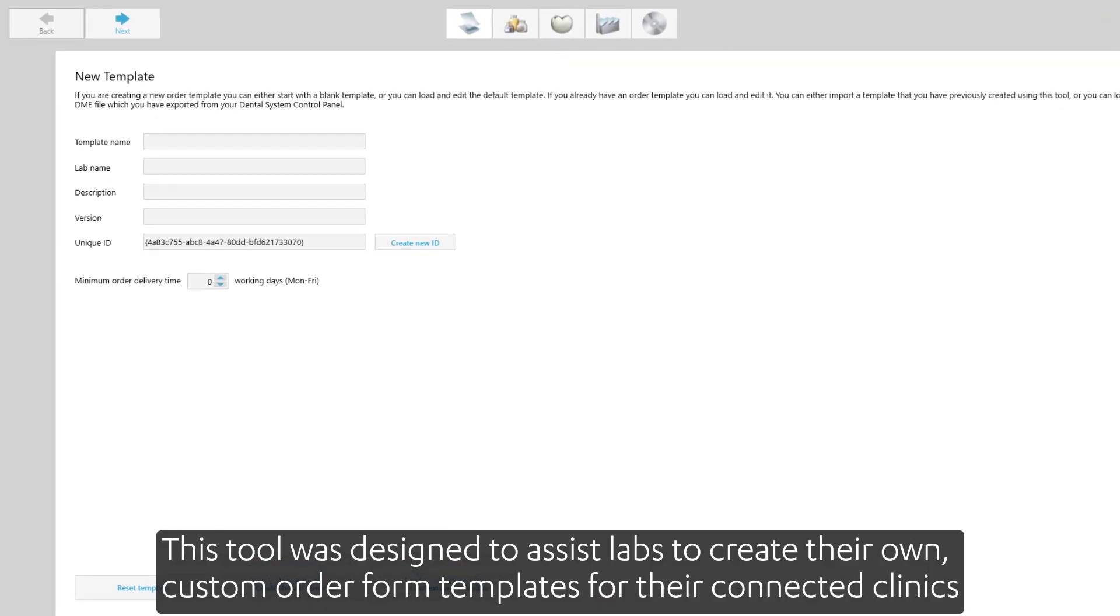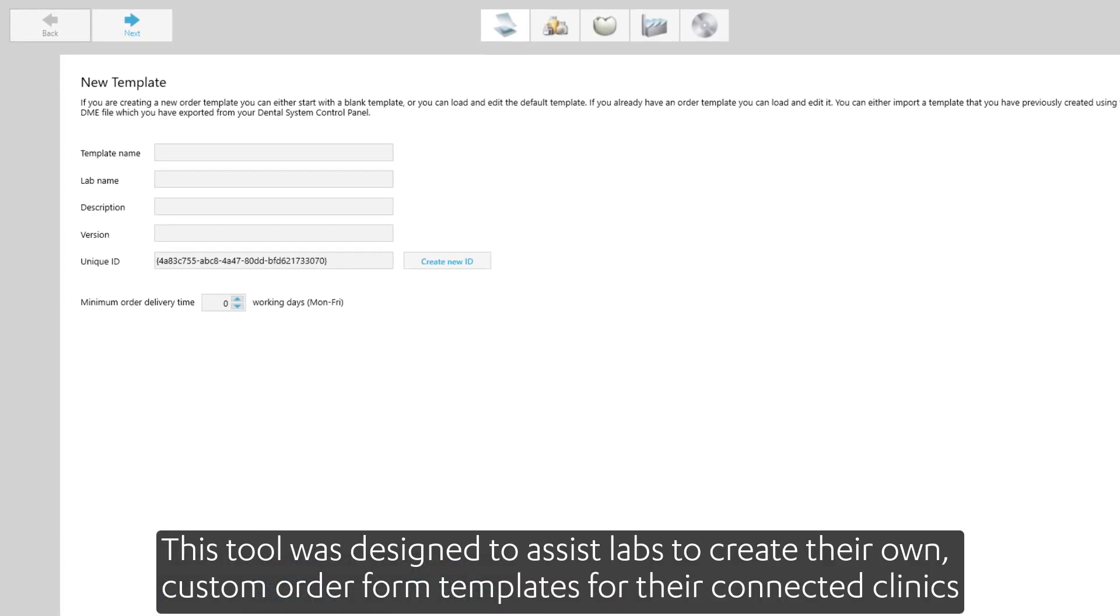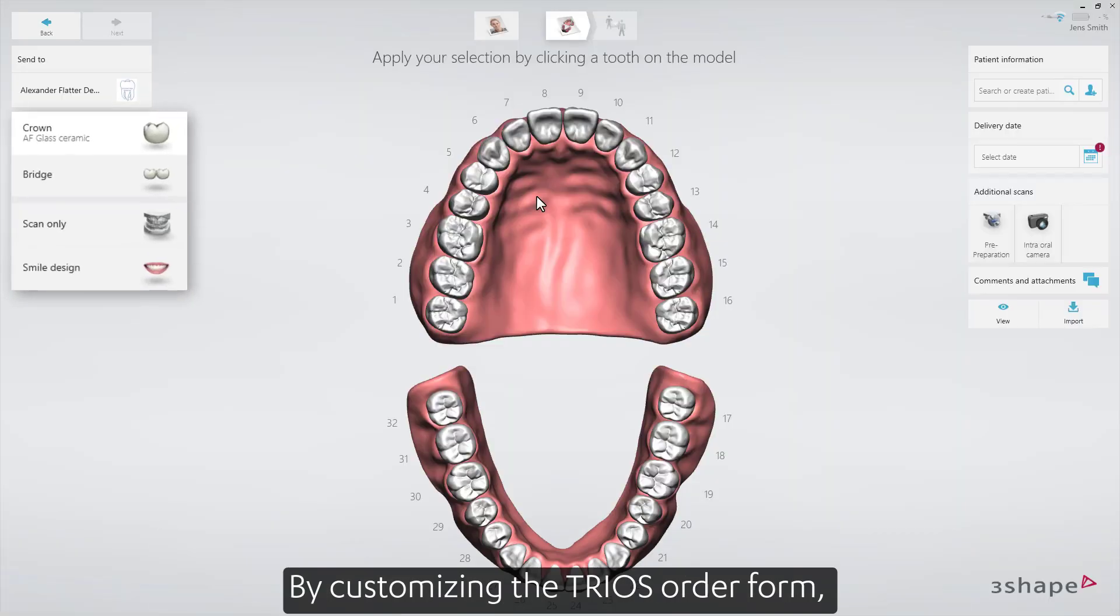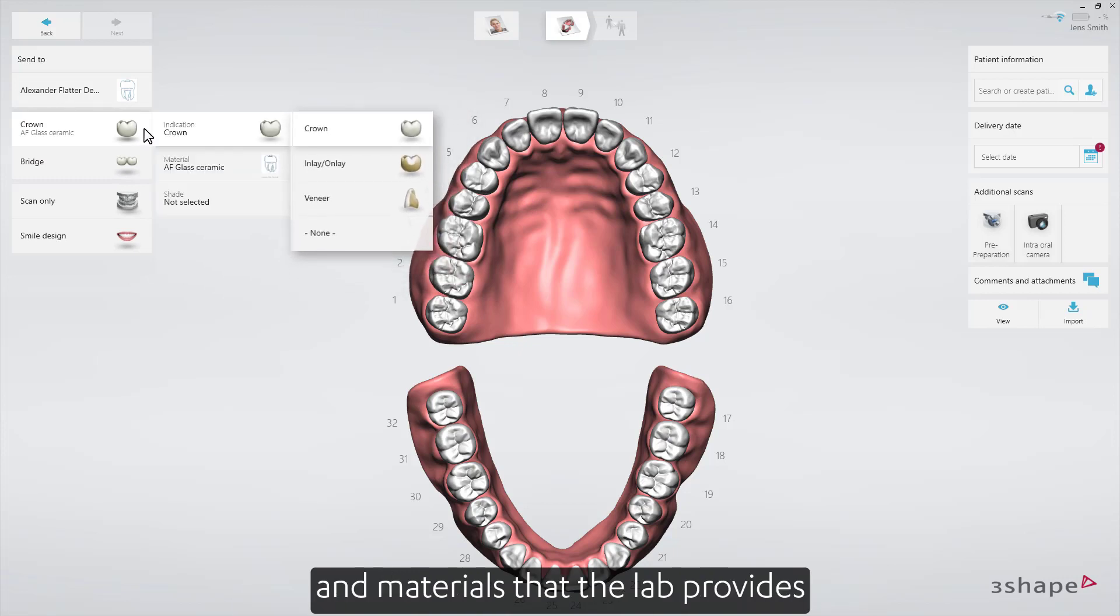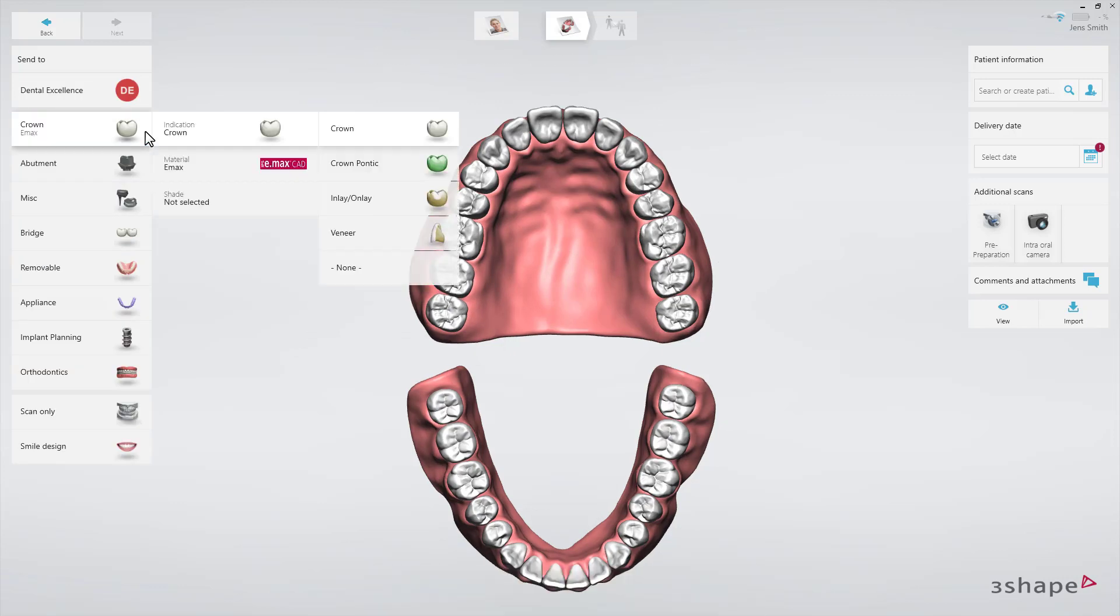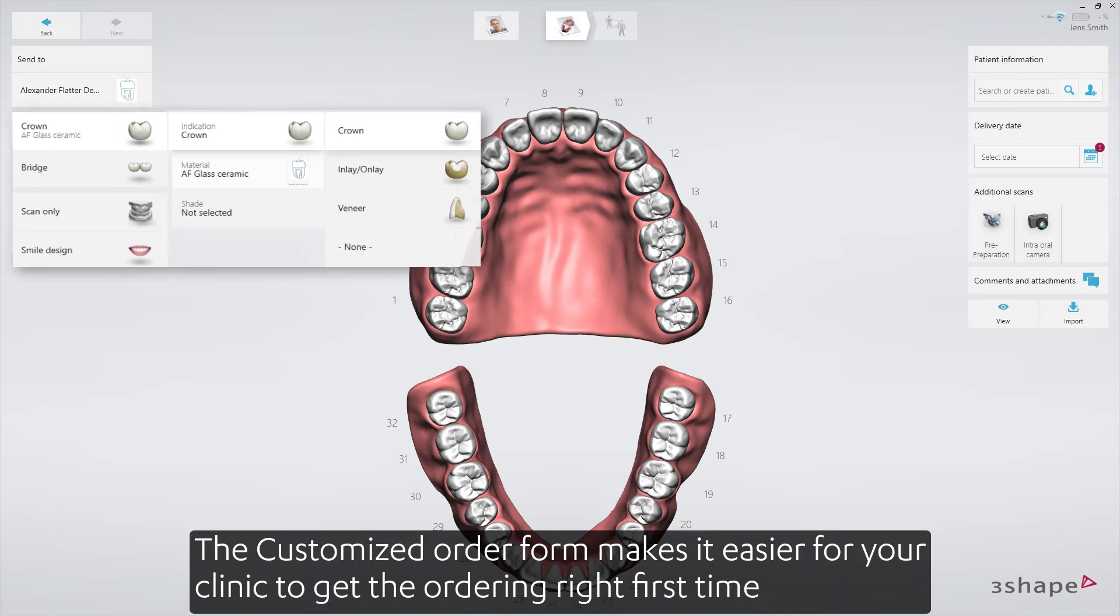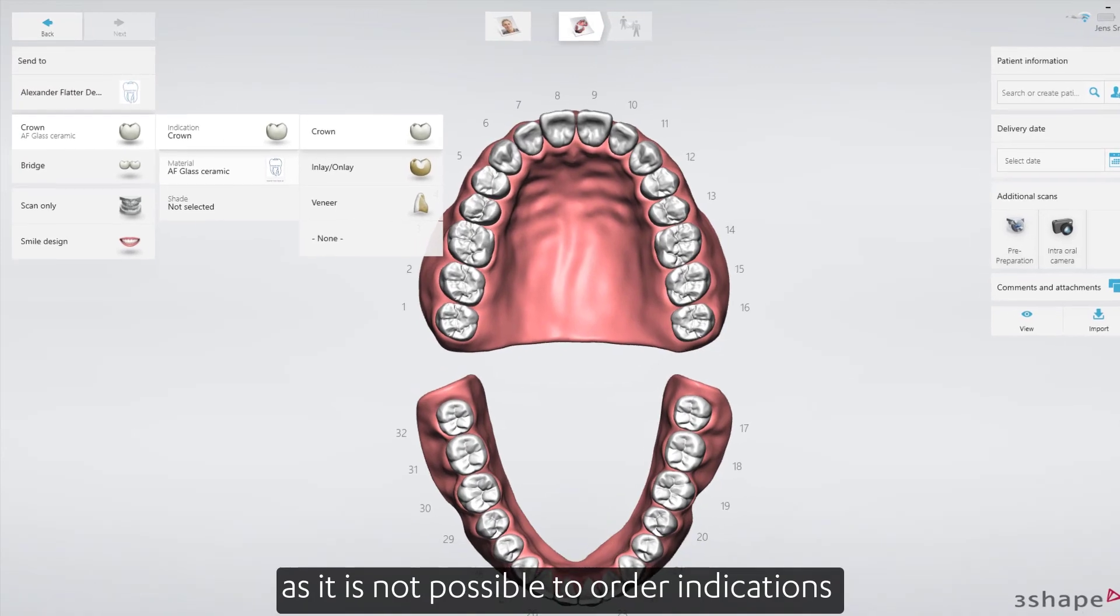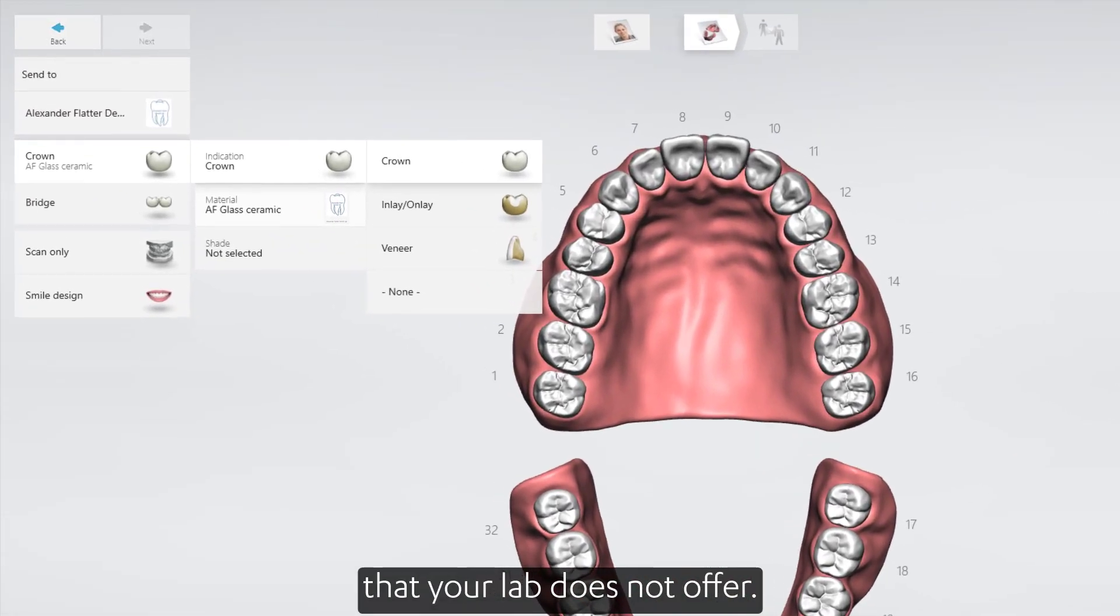This tool was designed to assist labs to create their own custom order form templates for the connected clinics. By customizing the TRIOS order form, clinics will be able to see only the indications and materials that the lab provides instead of generic options. The customized order form makes it easier for your clinic to get the ordering right first time, as it's not possible to order indications that your lab does not offer.